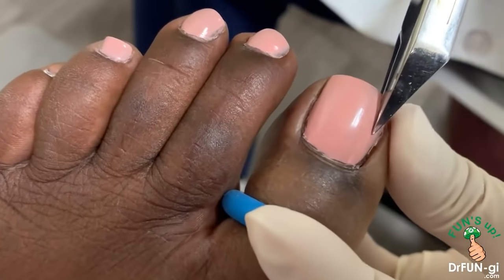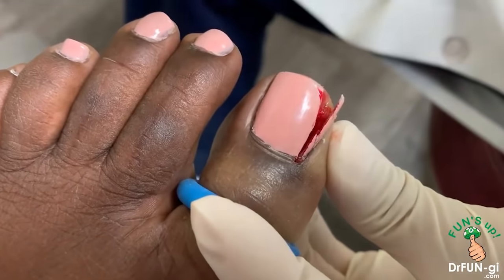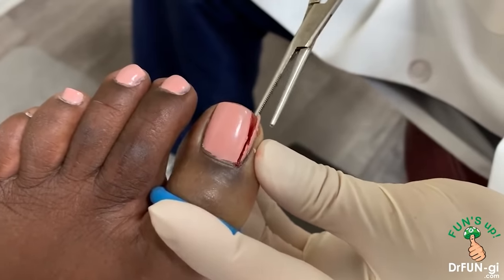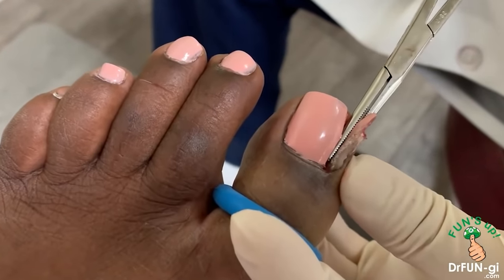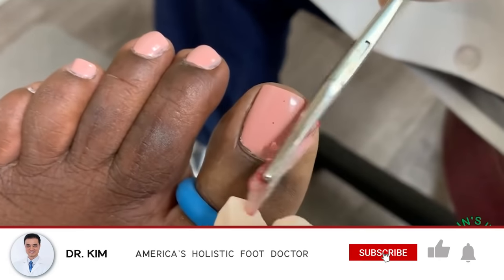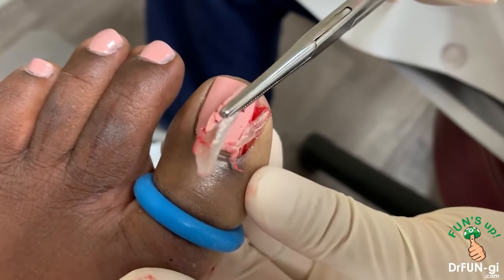Taking part of this pink nail off, all the way down to the base of the nail, and pulling this off. That was a big one right there — and the skin over it. It's a big one, as you can see.